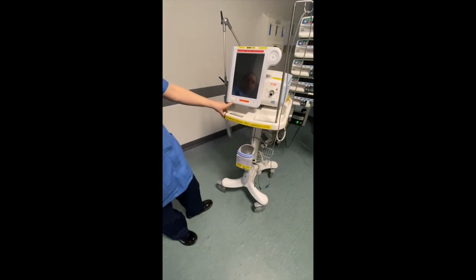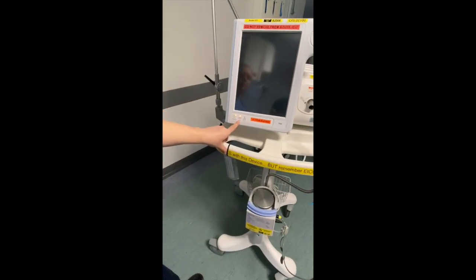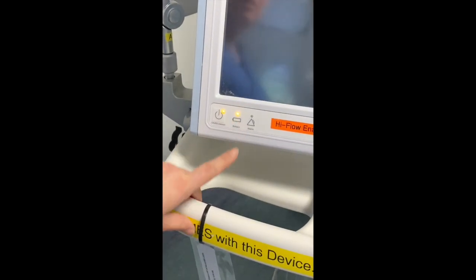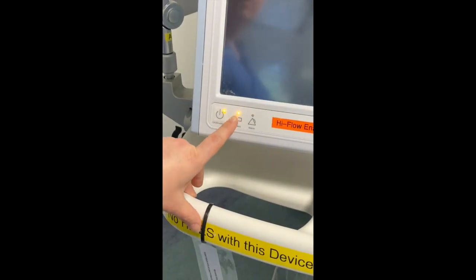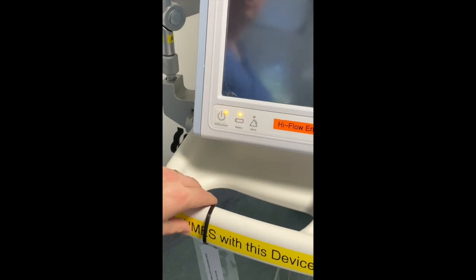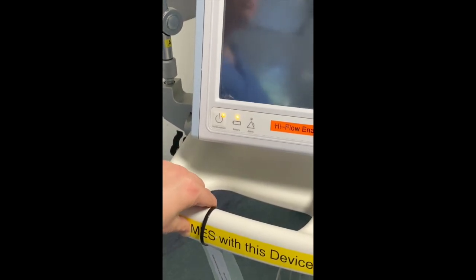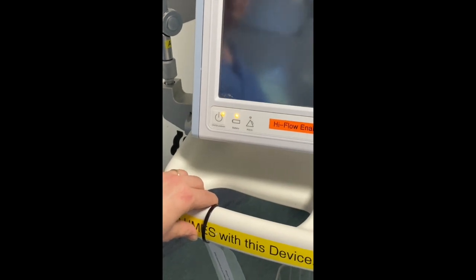If you look at your front screen, you've got a battery light which is on. If the battery is depleted and it's charging, the battery will be flashing. If it's just a constant light on it, then your battery is fully charged and it will give you five hours of running time without the AC being plugged in.